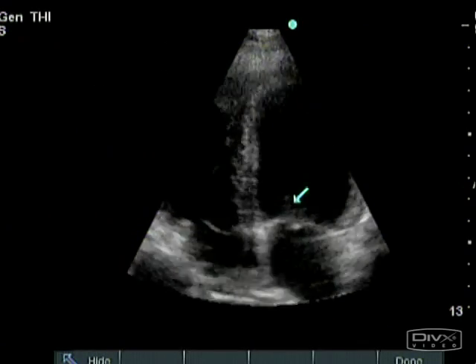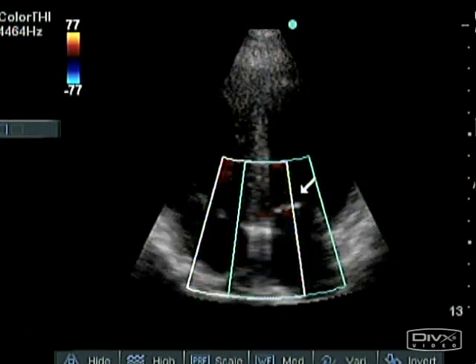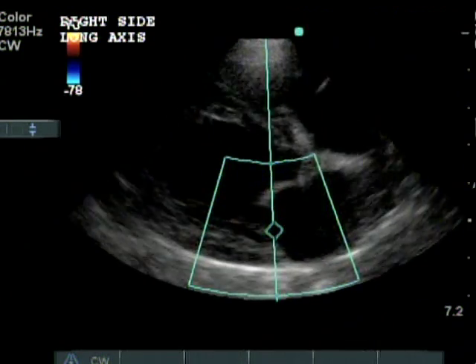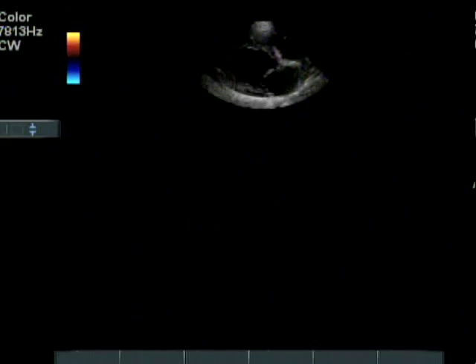I teach you how to use Color Flow Doppler to find flow lesions, and how to use Spectral Doppler to measure and interpret valvular flows or lesions.